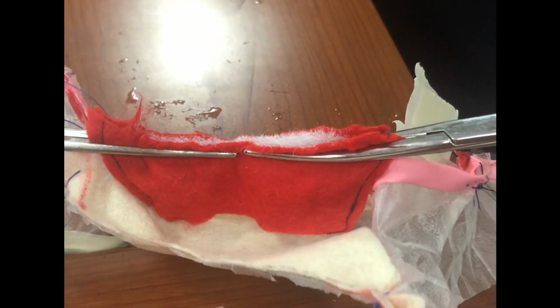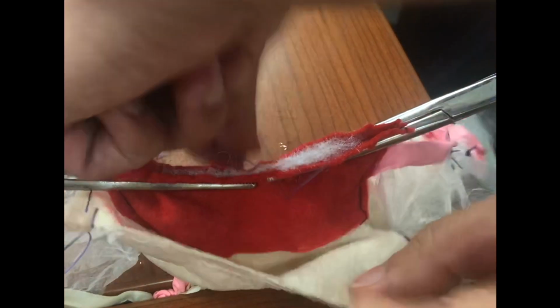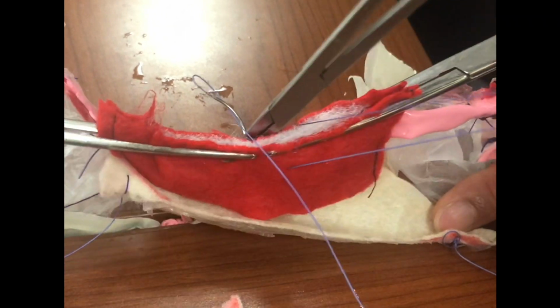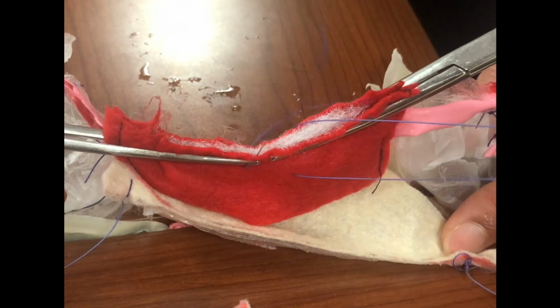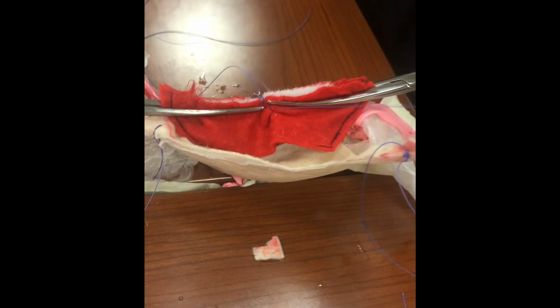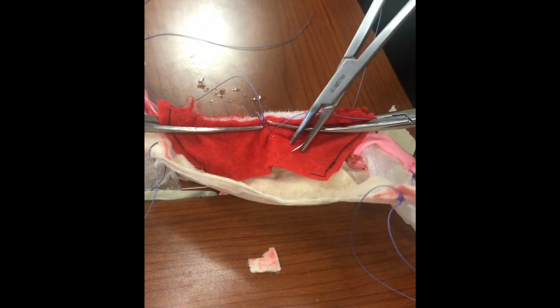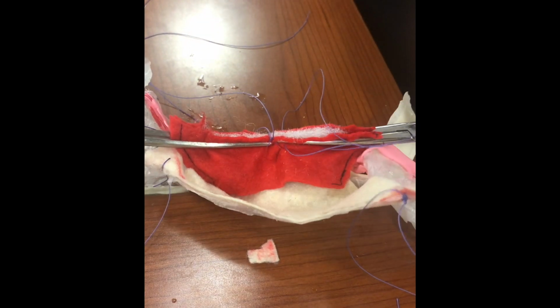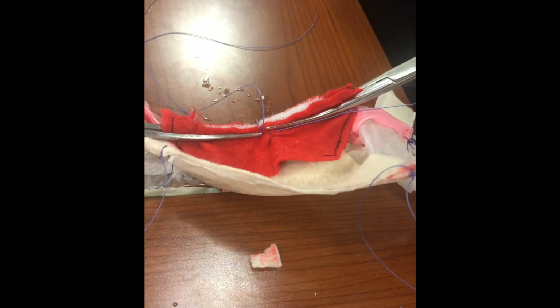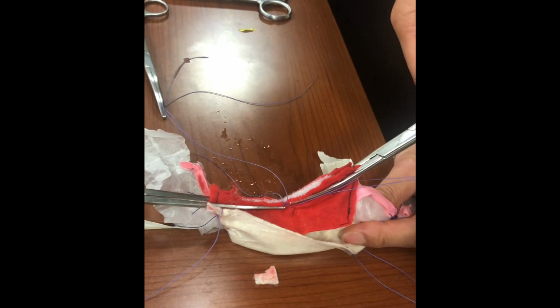You are now left with a vaginal cuff. For cuff closure, place a figure of 8 stitch at the midline of the cuff. Then proceed to suture ligate off your clamps to close each side of the vaginal cuff. Place your suture needle posterior and come out underneath the clamp. Tie your knot to cinch down the side of the vaginal cuff.